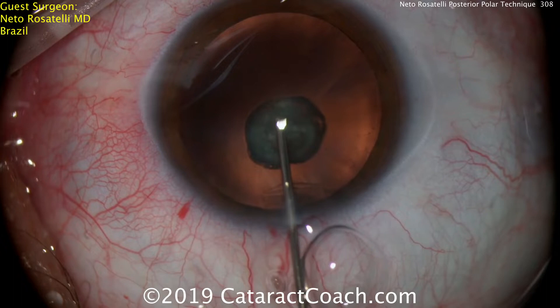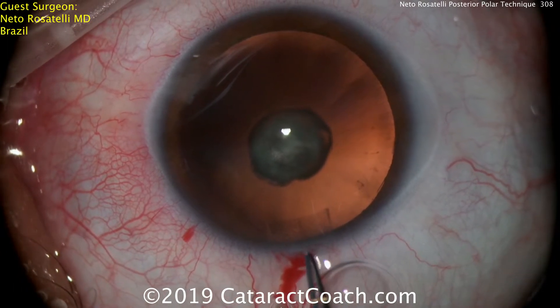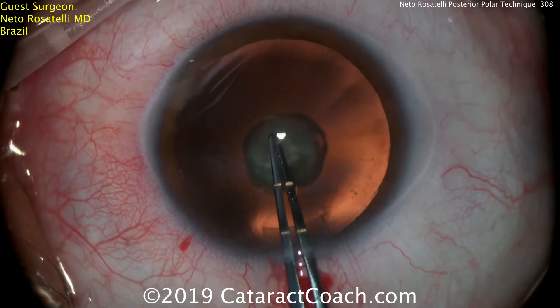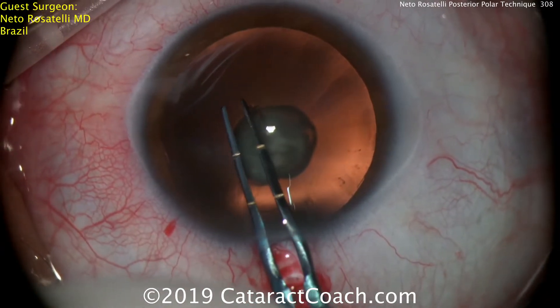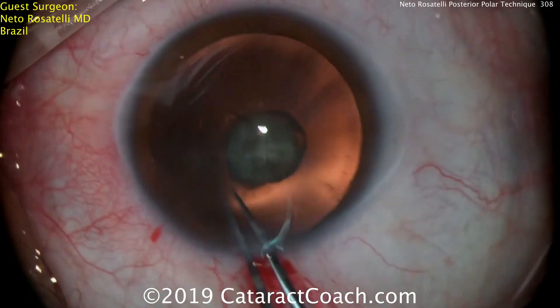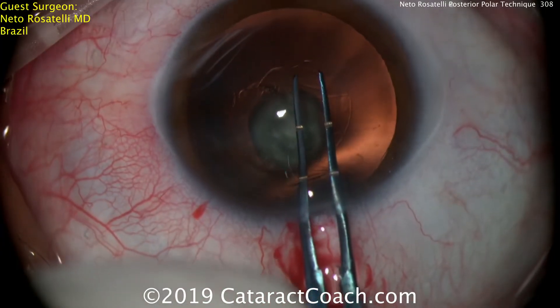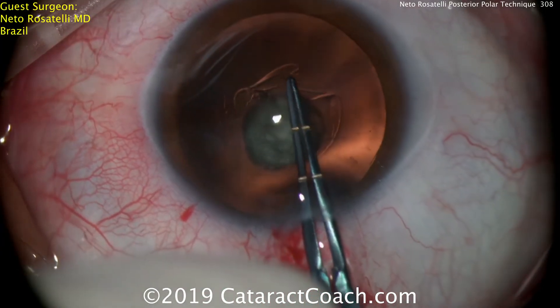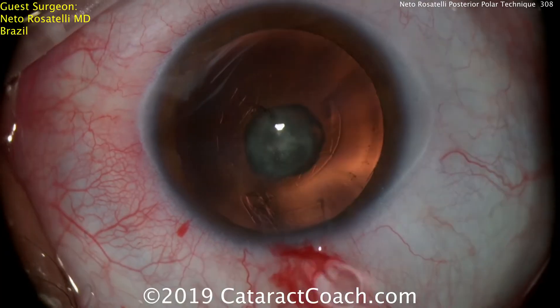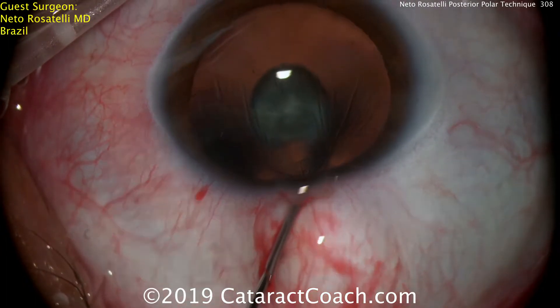We have to be very careful here in these cases because the capsule can break, so we want to avoid hydrodissection. He's using forceps marked at two and a half and five millimeters, and he'll start off by making a capsulorhexis. It's very important to have an intact round five-millimeter capsulorhexis, because studies have shown that about one third of patients have a risk of posterior capsule rupture in these eyes. If we need to place a sulcus lens, we need a good capsulorhexis. There's the capsulorhexis — letting out a little viscoelastic before he starts.